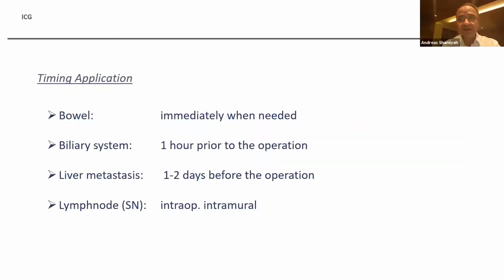So, Walter, you also asked about the timing of application. We made a protocol on more than 100 patients, and we realized that the average appearance of the color in the optic is 25 to 39 seconds after application. As Colin said previously, you have to be really ready, and the staff in the OR must have everything finished, the lights down in the OR, and then you can tell the anesthesiologist to give it intravenously. Then it takes 25 to 39 seconds.